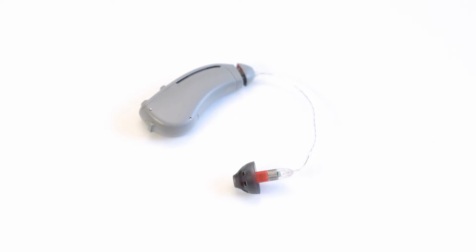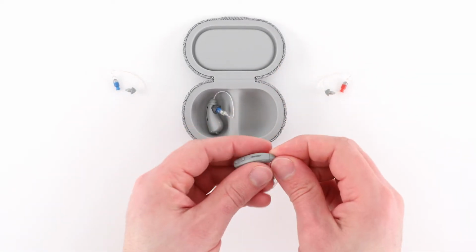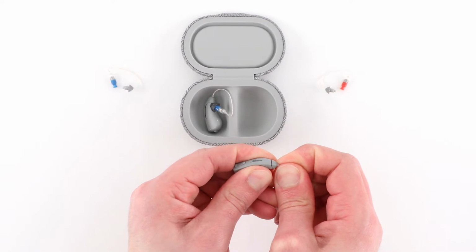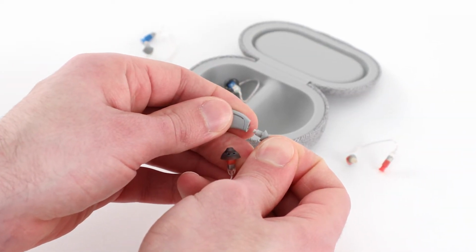Pick up the hearing aid and then grab the tip at the end of the cable close to the body. Firmly pull until it detaches from the hearing aid. You may have to pull harder than expected.